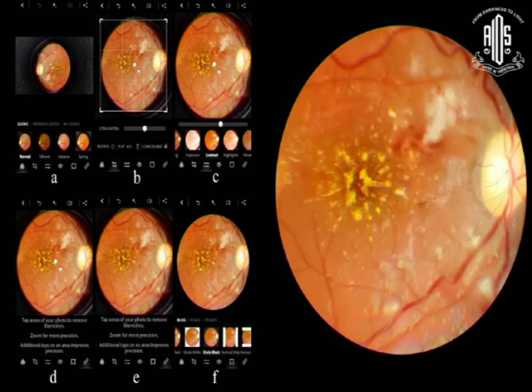And your images can be edited on the phone itself using Adobe Photoshop Express, which is freely downloadable, or if you want premium features, you may have to pay for it. The images are cropped and rotated, and these two central reflexes, which are common with the technique we use, can be removed using a blemish removal tool.